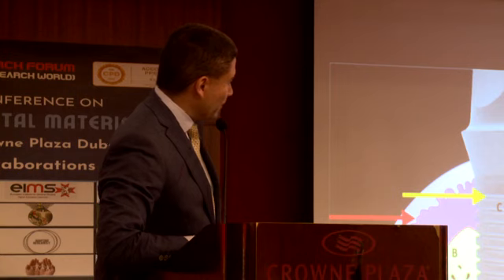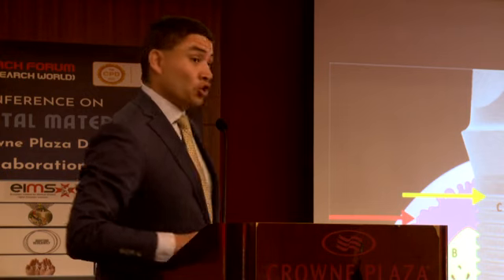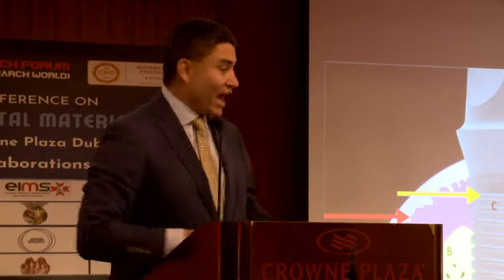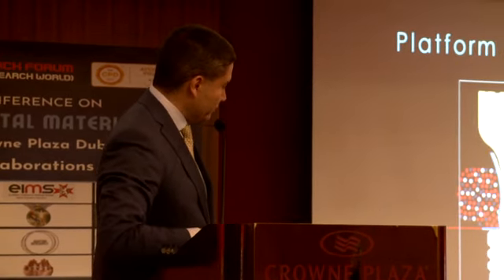Because 1 millimeter in here and 0.5 millimeters here gives you the 1.5, right? So you should be looking at the implants in the market that have 1 millimeter or more of platform shifting.